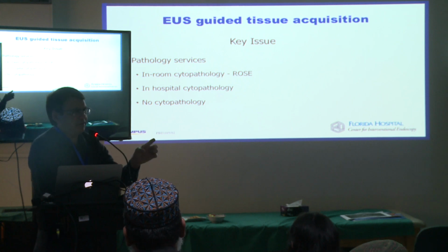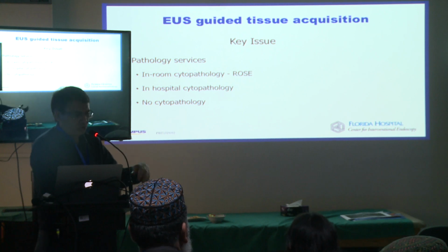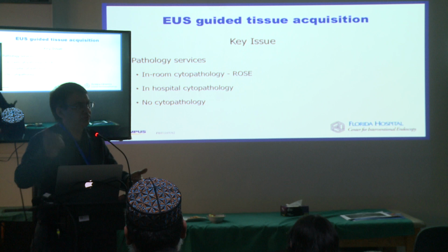Those trained people make the slides, but you have a cytopathologist in the hospital at least, so you don't have to send outside the hospital. Okay. A lot of hospitals may have to even send the slides outside the hospital as well.